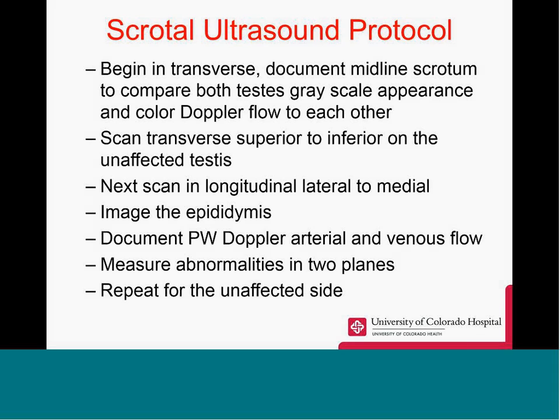After you've compared the testicles to each other, you're going to scan transverse in a superior to inferior fashion, usually starting with the unaffected testis. After you scan top to bottom in transverse, you'll then turn longitudinal and image the testicle lateral to medial.